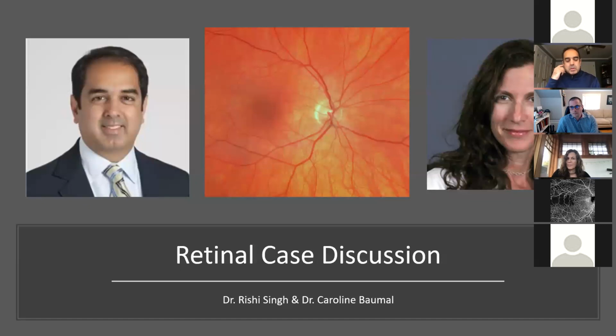So I would say the answer is somewhere in the range of less than 200, but not zero, is the tolerance level. And I think we make more of subretinal fluid than it needs to be. I think we think of it as the hallmark of exudative AMD, but in reality, it may not be that way. And so it's probably someplace in between, though the evidence is not great. All we know really is that the IRF should be dried up as much as possible, and we really want to try to address that as much as we can. I'm not saying we tolerate SRF, but I think we will certainly keep injecting until IRF is gone and then leave maybe some subretinal fluid behind, if that makes sense.